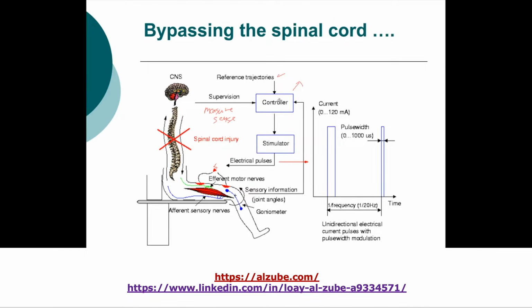And if there is a match, there are ways for us to look for these matches, for patterns in large data sets, using something called cross correlation. So if we can do cross correlation between a measured signal and the database, and we have a match, then you say, okay, go stimulate the right leg in order for it to lift the lower foot.